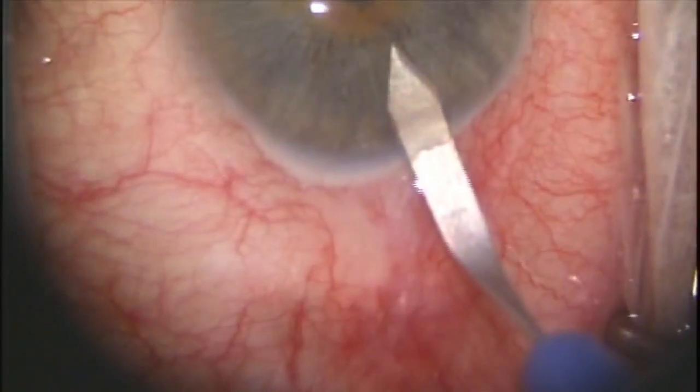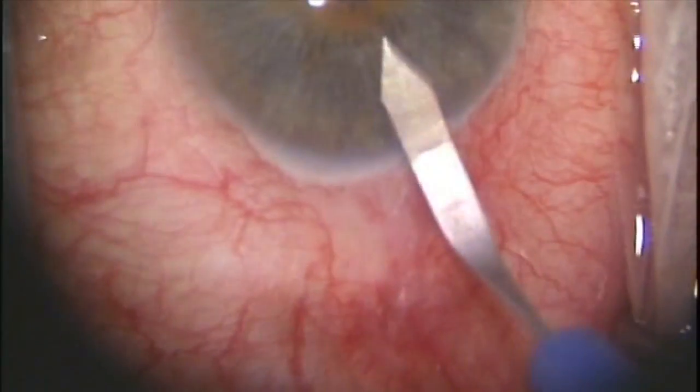In the beginning, I would recommend making a standard linear incision. I wouldn't get fancy. Once you have some experience, I would advocate flaring the inner lip of the incision. That'll allow you to get a wider treatment arc, and I do believe that you can achieve lower pressures with a wider treatment arc. For a surgeon who has no experience with angle surgery, it's a completely different feel, and that's why I really advocate taking the time, even 2-3 months before you do your first case, to start practicing going through all those motions. It'll make a huge difference.